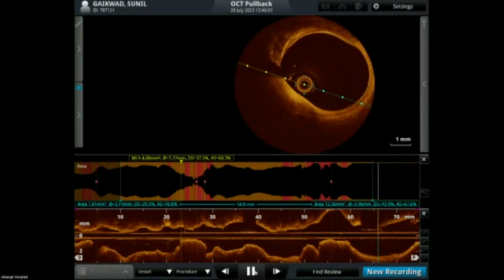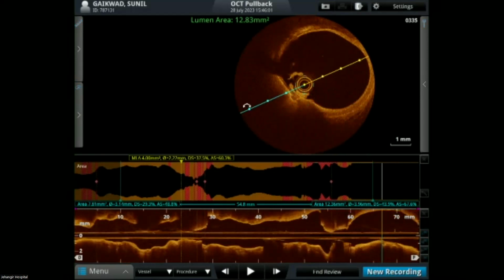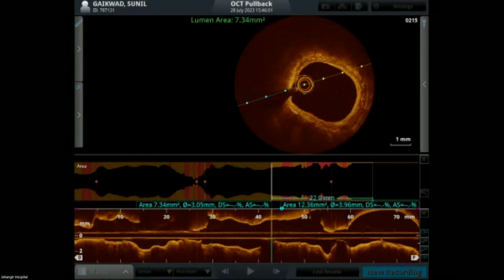Let me ask the panel what we think of this strategy. So we'll go to 1.75, sir. Let's give this, Corsair. Corsair, in an acute MI situation?